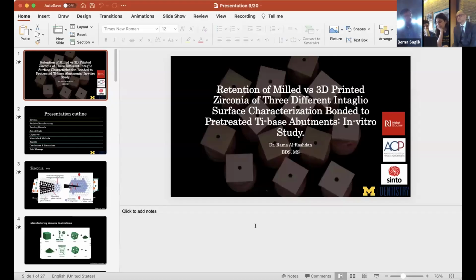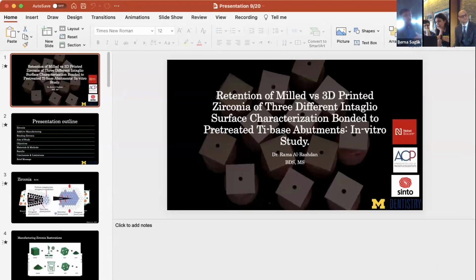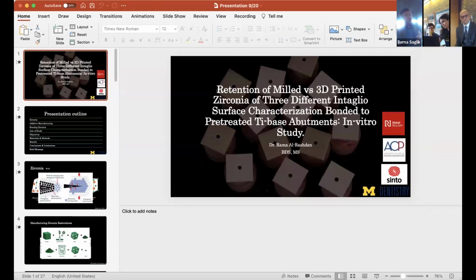The printers can do mass production now, but they don't. I don't think a chair side level 3D printer would be able to do the level of detail that we need to create some of these shapes and structures. That would be the challenge. And with full ceramic, after you print it, you have to fully debind it, burn off all the resin, and then fully sinter it into a solid monolithic ceramic or a varying porosity ceramic, depending on your application. That technology or skill set is left up to ceramicists and material scientists to make so that it can be done faster, more efficiently and controlled.